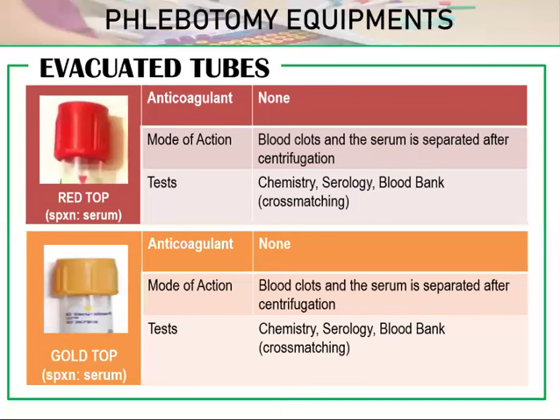And for the plastic one, if you can see a plastic red top, you may notice that there is something inside. So that is not an additive, that is particles, specifically silica. Okay, silica, S-I-L-I-C-A, silica particles inside our red top. The reason for that is that the silica particles are there in order for the blood to clot. In the glass top, there are no silica particles.